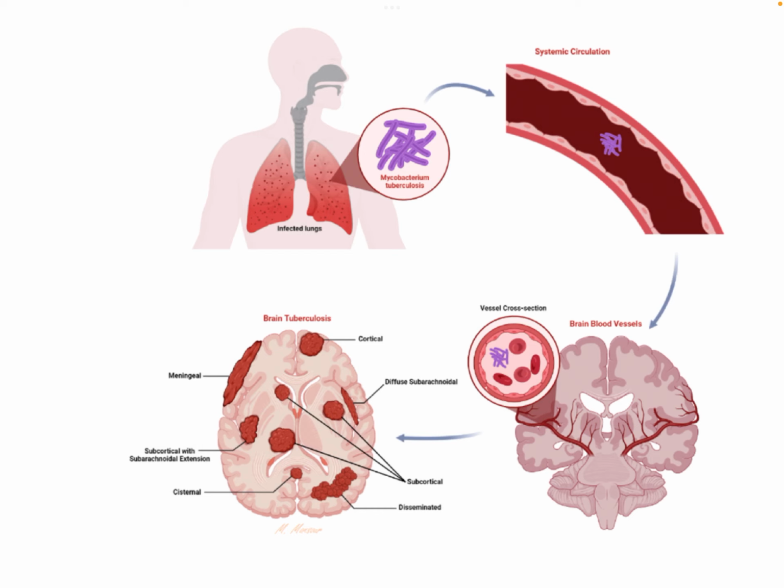So how to diagnose tuberculoma and neurocysticercosis? Sometimes it becomes difficult in clinical situations, because tuberculoma and neurocysticercosis look more or less similar on imaging findings like CT brain and MRI, and there is a diagnostic confusion. So in that situation, we will discuss a little bit how to diagnose tuberculoma and neurocysticercosis confidently.